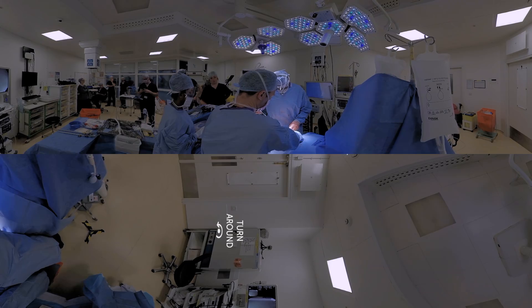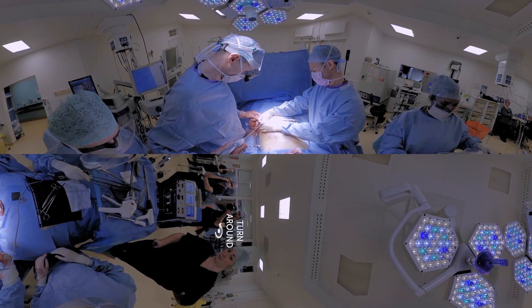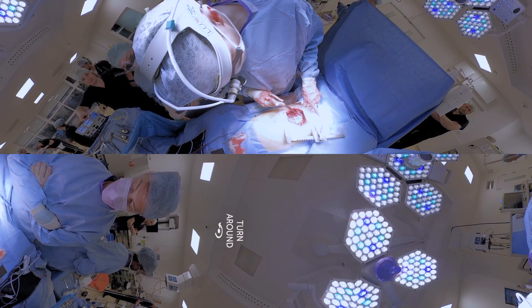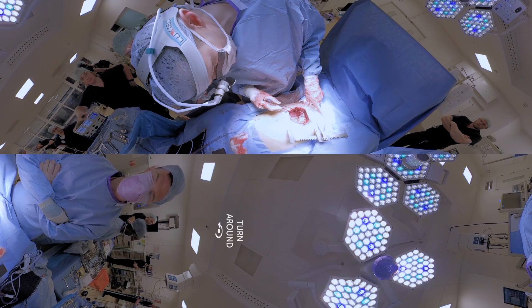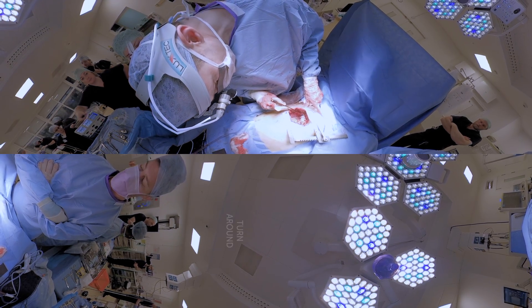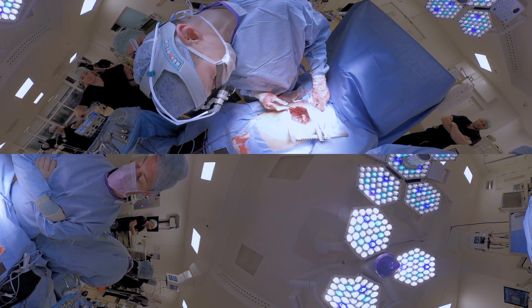So the moment of truth — we can now pull the esophagus up out of the chest. This is the stomach tube that we made earlier in the abdomen, brought up into the chest, and joined on to the esophagus there, right at the top of the thoracic, or chest cavity, where it becomes the neck.